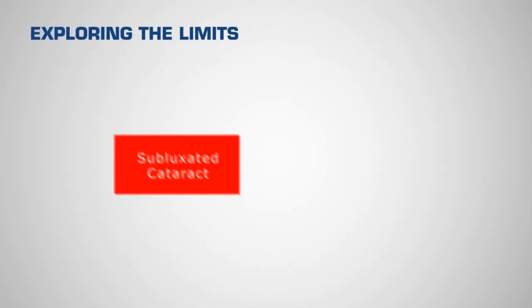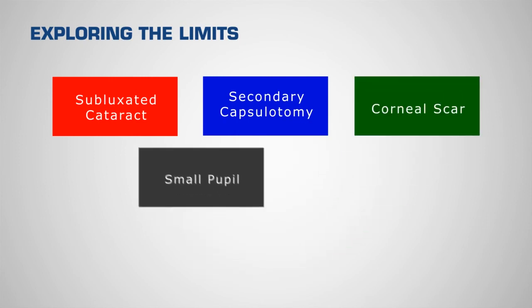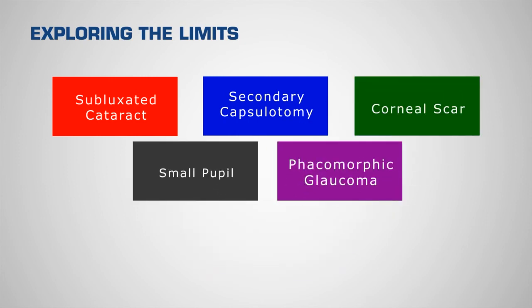To conclude, this video demonstrates exploring the limits of femtosecond cataract surgery and the customizations required in cases with a subluxated cataract, corneal scar, small pupil, phacomorphic glaucoma, and performing a secondary capsulotomy in an aphakic eye.